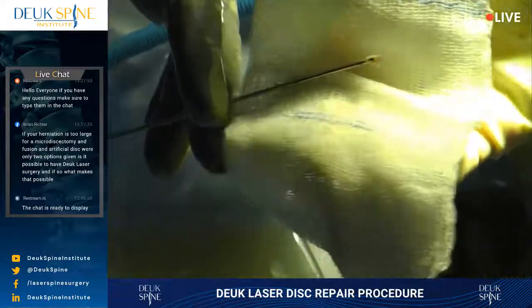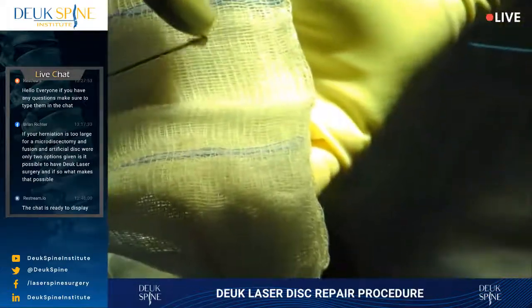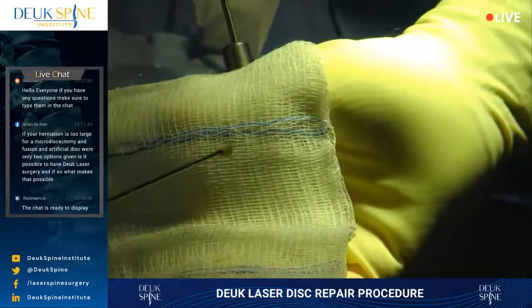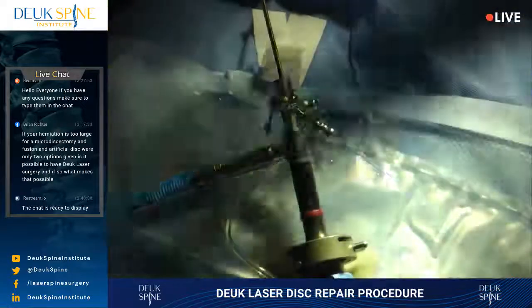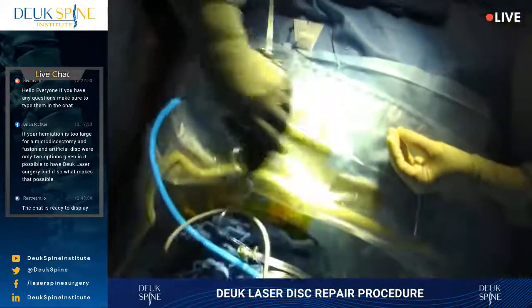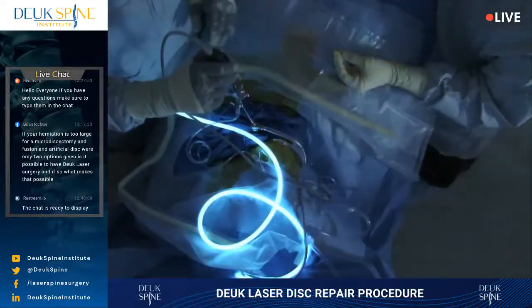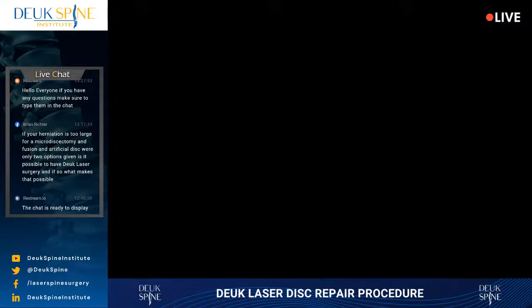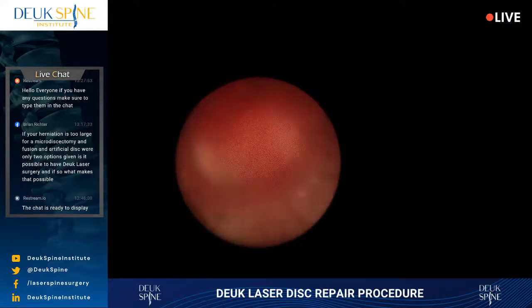That is herniated disc. And look at the pinkish color in there. See that pinkish color right there? That is inflammation, right on the herniation. Her body is getting inflamed from the herniation. It causes inflammation in the back of the disc. That's what I fix with the laser surgery. It's the only surgery in the world that fixes that, the Deuk laser disc repair, because that's what I'm specifically targeting.